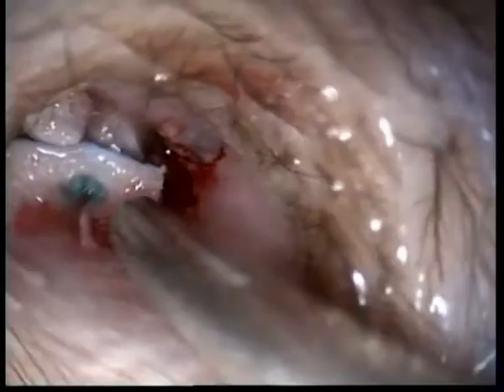Alright. Under the light? That's fine. Whatever. I need gel foam. Give me a smaller section than that. So I'm taking out the, give me an alligator, please. Why can't I open up this alligator?